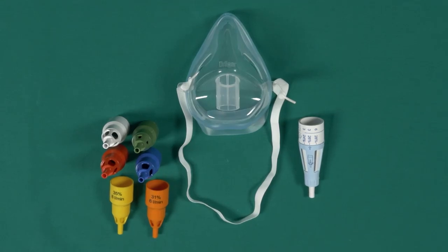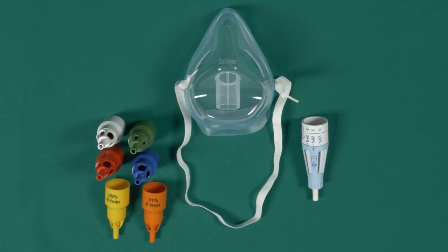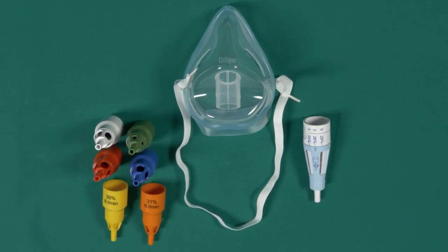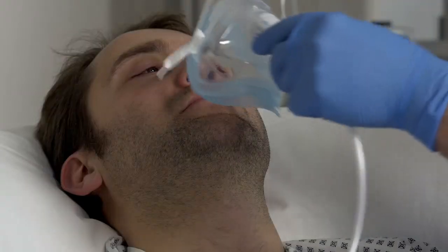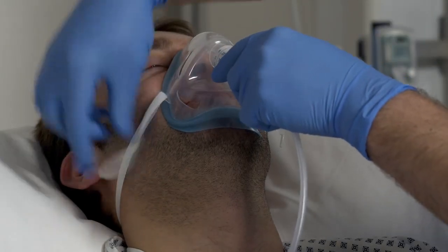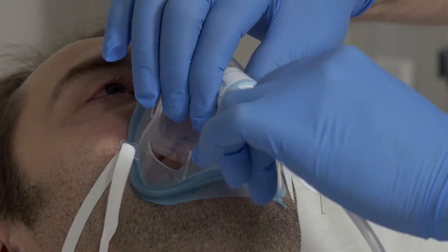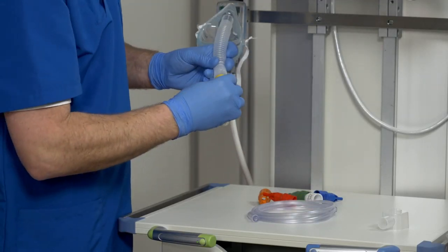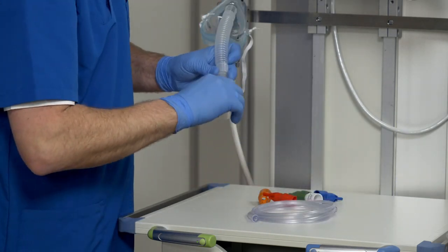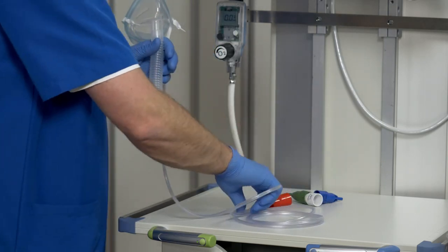Venturi masks are high-flow oxygen masks that provide the total flow required. They can be set to an exact oxygen concentration of 24 to 50 percent in stages. The mixture is determined by the opening on the Venturi valve, not the patient's breathing pattern. The Draeger O2 Star Portfolio offers a Venturi mask kit with an adjustable valve and a fixed Venturi valve. The advantage of the adjustable valve is that the oxygen concentration can be changed without interrupting the therapy. In both Venturi systems, the breathing air can be humidified with the humidifier cap. Connect the included inhalation tube and the humidifier cap to do so. It is also possible to add an active humidification system.